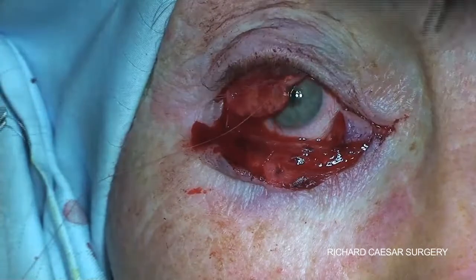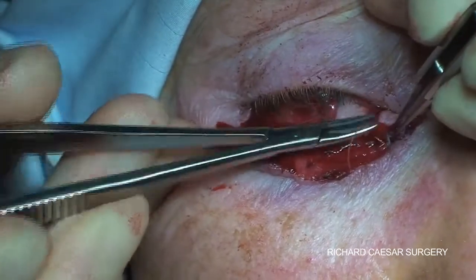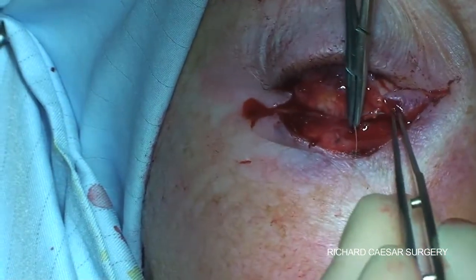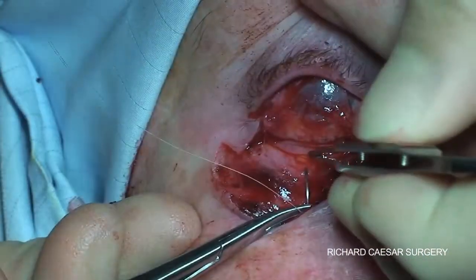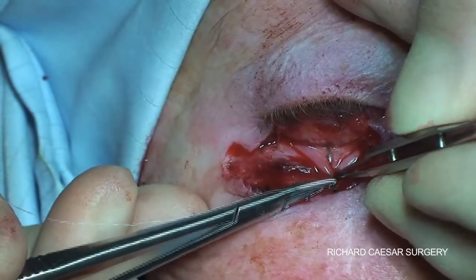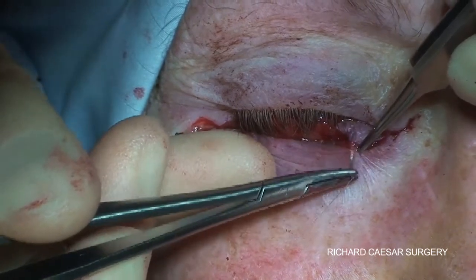This is a 6-0 Vicryl suture, with two sutures attaching superiorly and inferiorly to the tarsal plate in the lid, in exactly the same way as you would close any lid. With these sutures in place, the conjunctival edge is found in the fornix and picked up. The easiest way to pick up the tarsus is to use the tip of the needle just to tuck in and lift the tarsal plate, at which point you can get hold of it easily with the forceps and place your sutures. This obviously needs to be continued to close the conjunctival fornix.